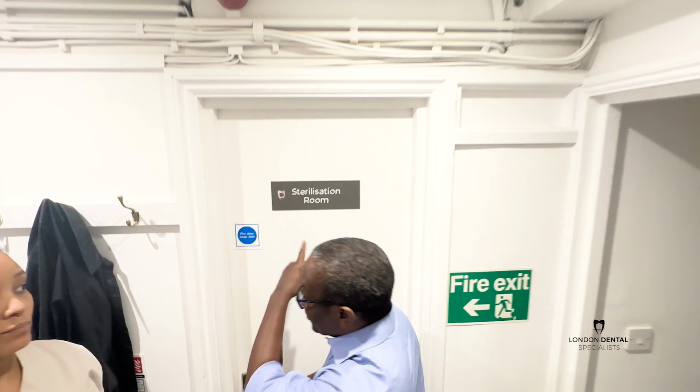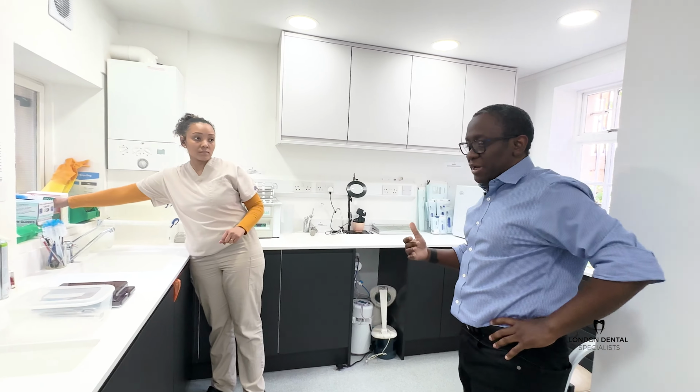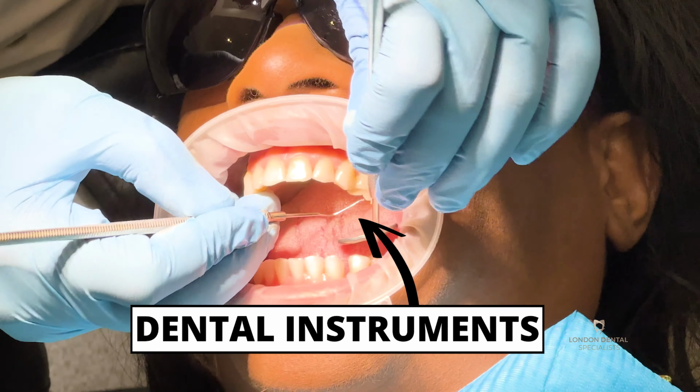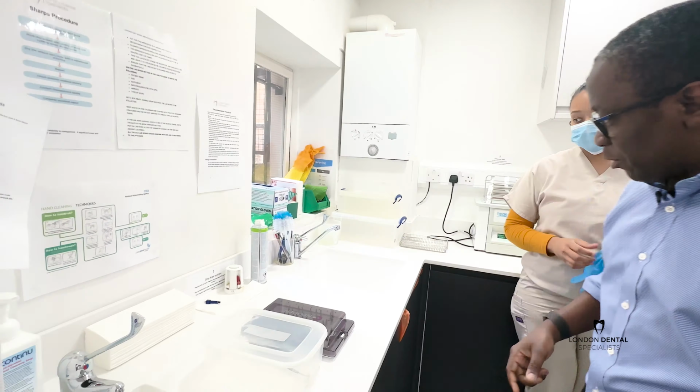Okay, so I'm sure many of you have walked past this room and wondered what was in it. So this is the room in which we essentially keep you safe. And it's designed in a way that the instruments that we've used on each individual patient come into the room. And as you can see, the room here is labeled the dirty side. So everybody that comes into our practice knows that used instruments are here. And then there's one sink for manually cleaning the instruments if you want to.